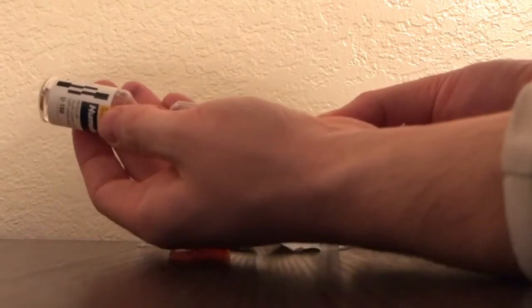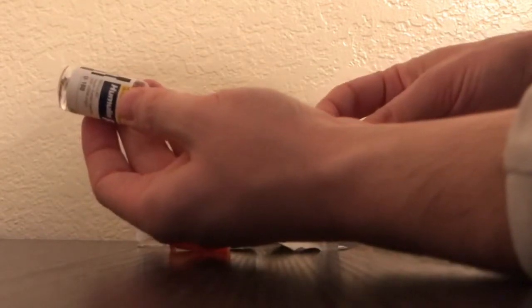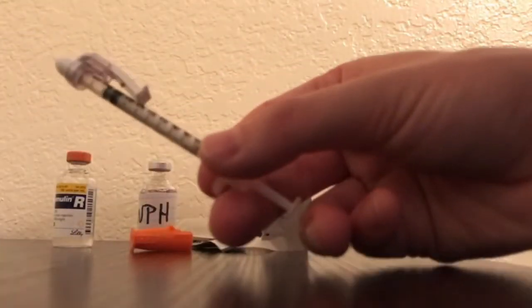Grab 10 units from there. You might have some bubbles; you can always flick them out. Make sure everything's up to par, then verify with a second nurse to make sure you got 10 units.